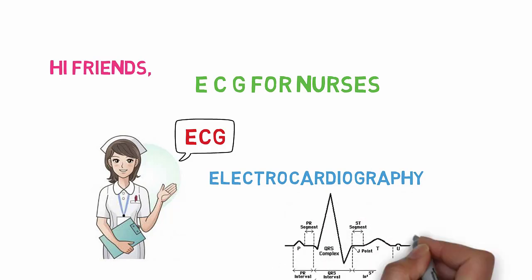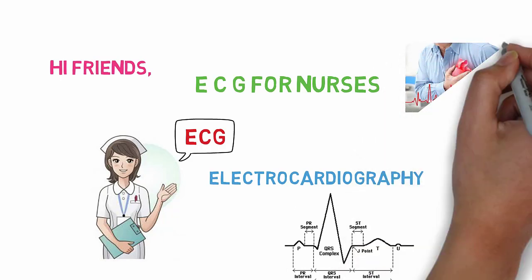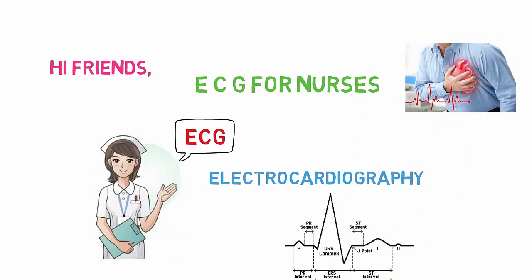It is an essential tool for investigating cardiac arrhythmias, that is abnormal rhythms, and is also useful in diagnosing cardiac disorders such as myocardial infarction, heart blocks, cardiac hypertrophies, and many more.